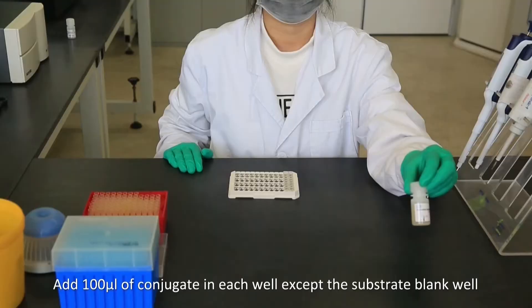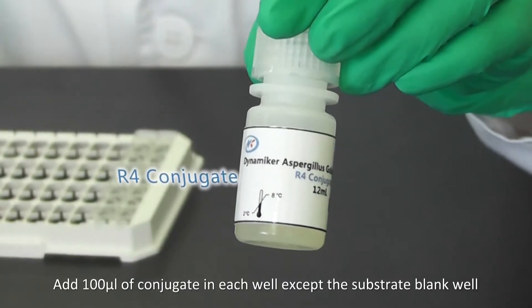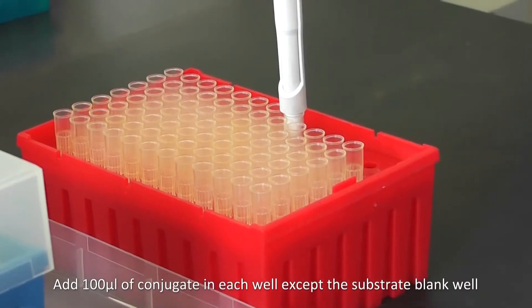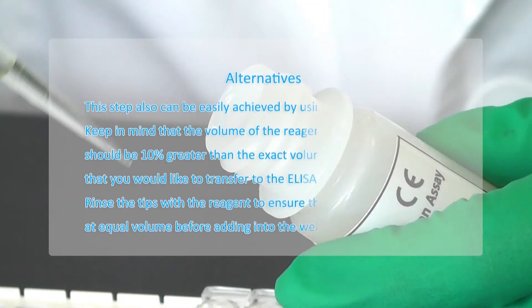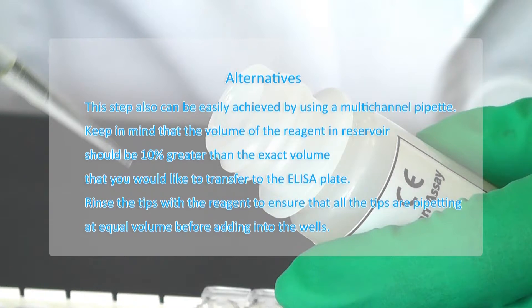Add 100 microliters of conjugate in each well except the substrate blank well. This step also can be easily achieved by using a multichannel pipette. Keep in mind that the volume of the reagent in reservoir should be 10% greater than the exact volume that you would like to transfer to the ELISA plate.